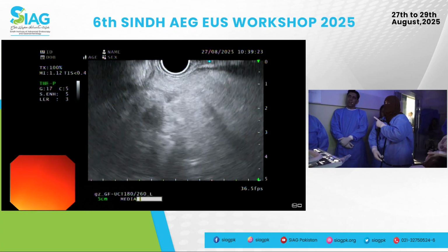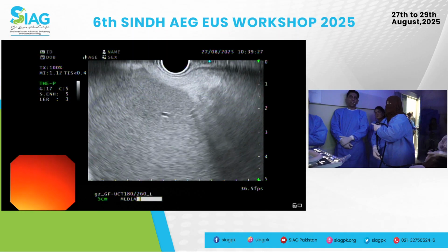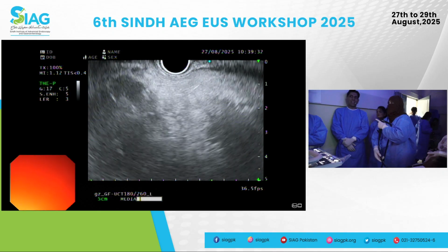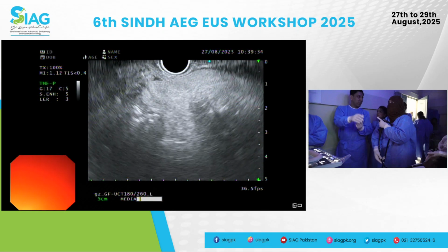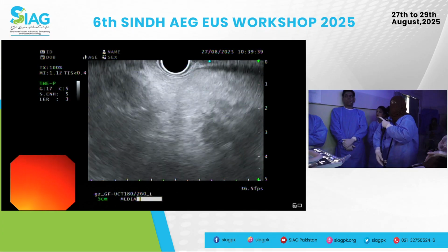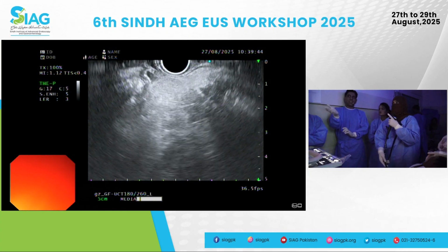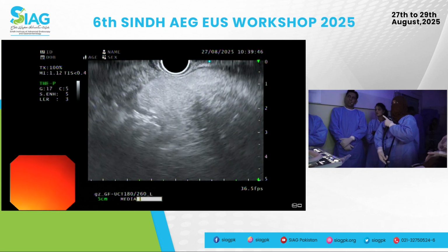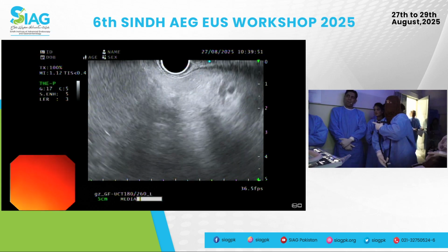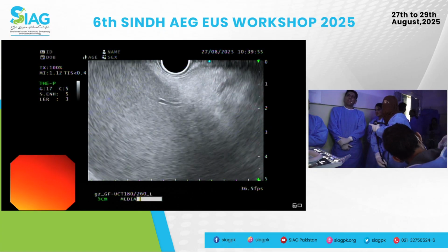It's fine. Tip up, and if you can rotate all the way to your right. Sometimes if you lose it, again, you're excellent. So you're seeing the spleen. Excellent. That means if there's anything in the pancreatic tail, it's unlikely if you've done a sweep and gone all the way to the spleen. If you've seen the spleen, the kidney is literally right next to it. So focus on the spleen. See if you can see, in the splenic hilum, the significantly dilated PD with some multifocal side branch dilatation. Good, excellent. And now the left kidney should be right next to it.